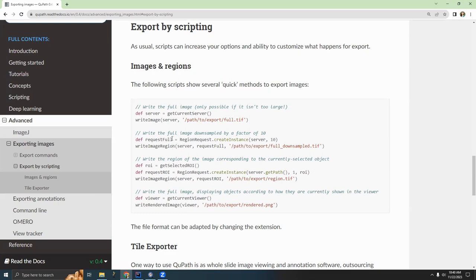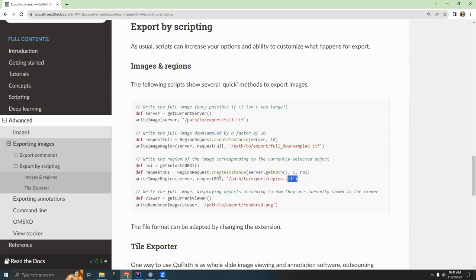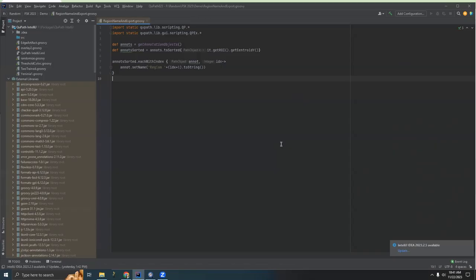This one, we're actually requesting the full image just at a downsample. And in this particular one, we're requesting a specific region of interest. And then we're going to just write that region. And so that's one that we want to base the rest of our script off of. So I'm going to copy this and paste it here, and then from here adapt it to more specifically fit exactly what we want.